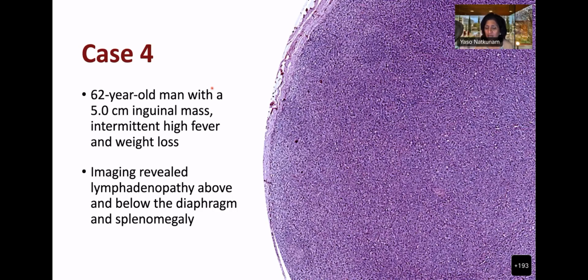And what's the other thing you're going to think about? DLBCL. So DLBCL will, yes. SLL. How about mantle? Mantle can have a diffuse pattern. How about marginal zone lymphoma? I don't mean for this picture, right? I'm talking about a diffuse pattern. So you can have marginal zone or mantle cell lymphoma. Mantle cell lymphoma would look a lot darker.